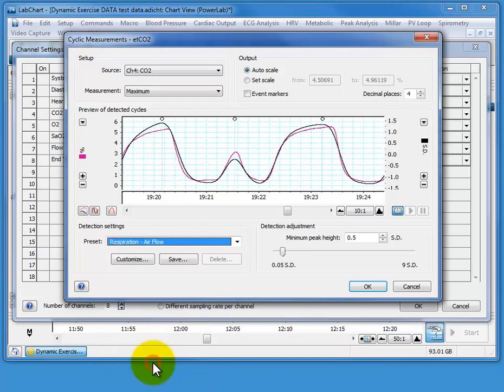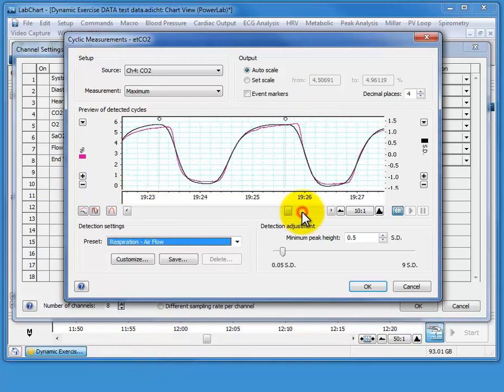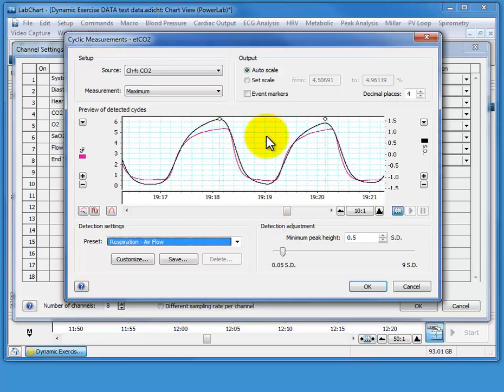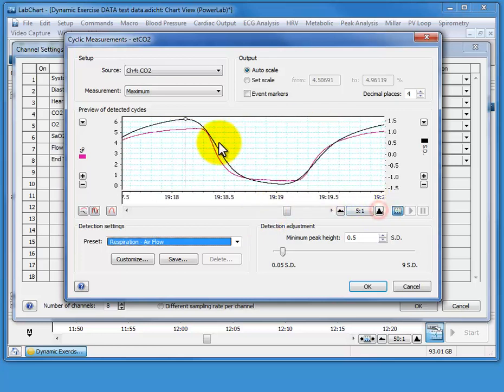We're measuring airflow. So immediately you can see now they've moved ever so slightly, and we're a little bit closer to picking up the little pink peaks here. And you can also see it's actually picked up a few of the half breaths that I was having a whinge about earlier. So let's have a look through that. That looks okay. However, on closer inspection you can see that the little peak it's put in here isn't actually on the end tidal. That's probably because maybe the flow isn't quite what it expects.